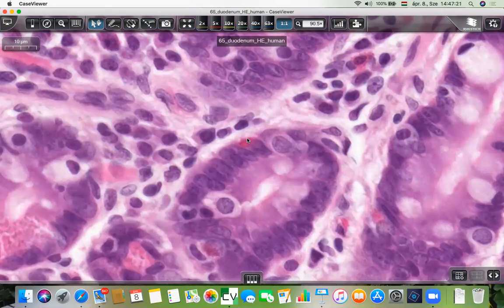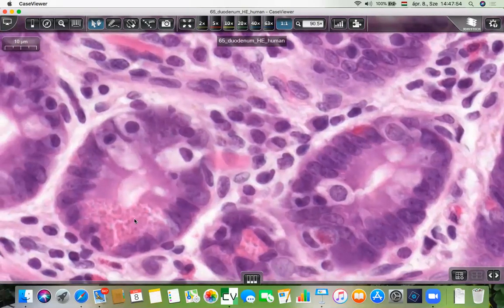You know, they secrete hormones, endocrine and paracrine hormones, and the bloodstream or the interstitial fluid carries it toward the targets. So it's easy to identify them here in the crypts of Lieberkühn because they accumulate their secretum at the bottom of the cells, while the Paneth cells represent the material at the apical part of the cytoplasm, the enteroendocrine cells at the bottom.